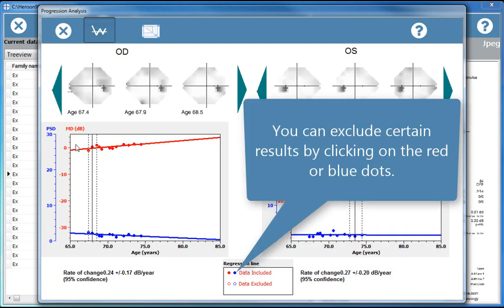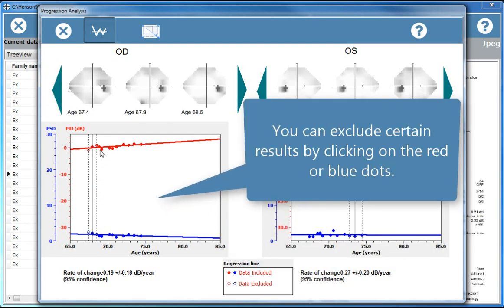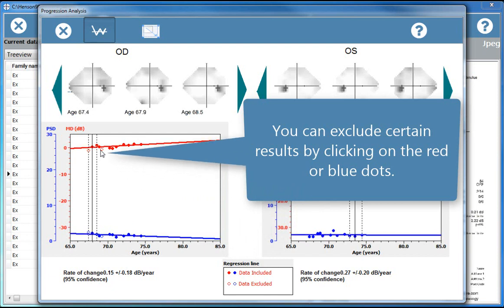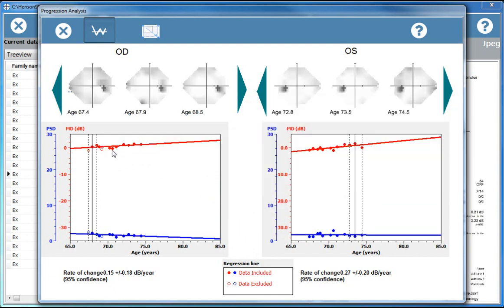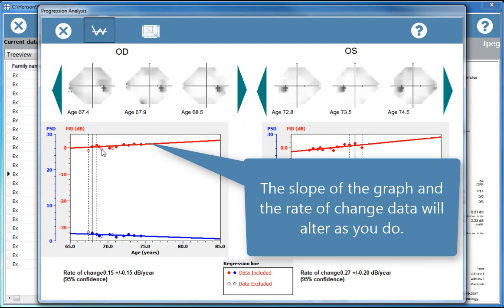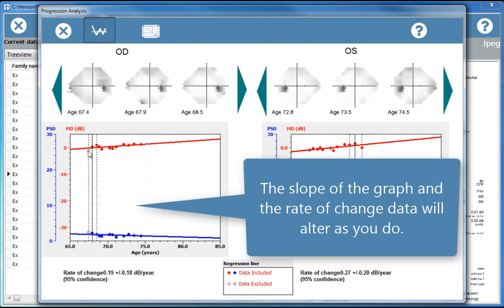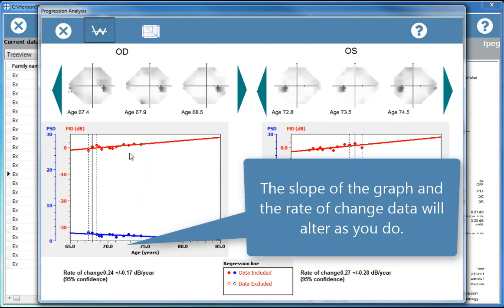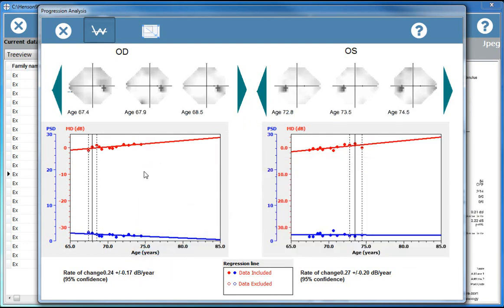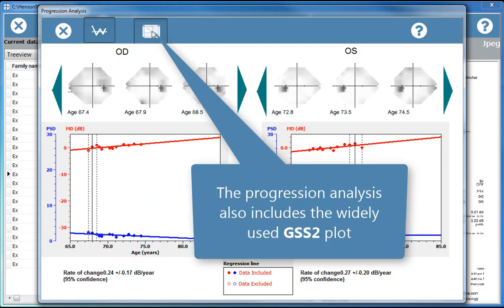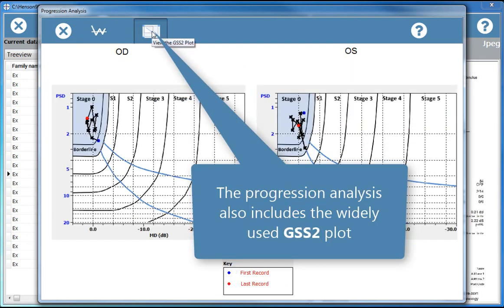You can exclude certain results by clicking on the red or blue dots. The slope of the graph and the rate of change data will alter as you do. The progression analysis also includes the widely used GSS2 plot.